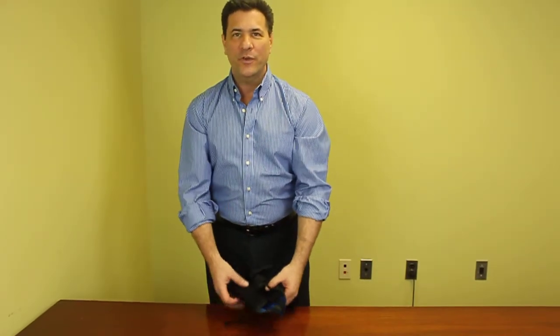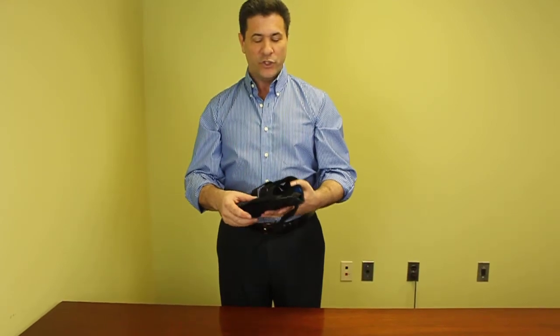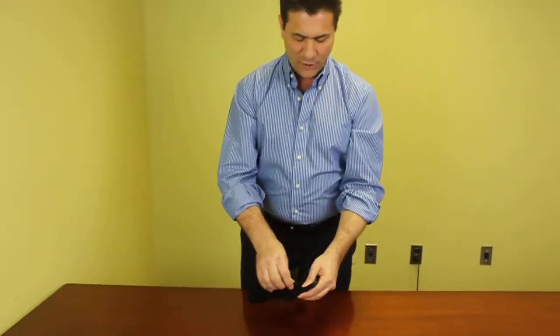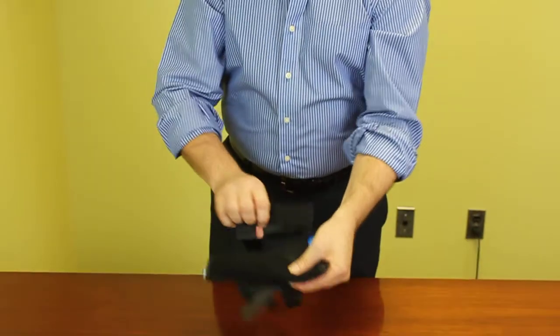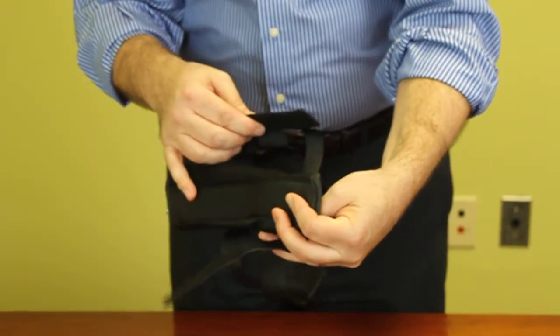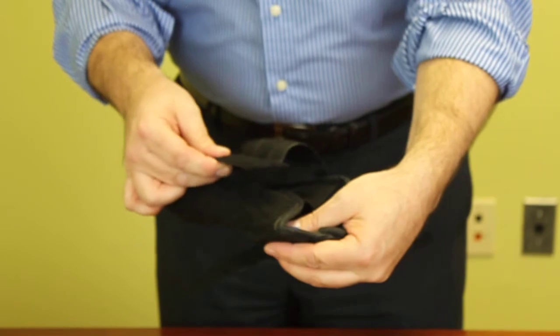Hi, I'm Andy and I'm here to demonstrate the Comfortland Universal Wrist and Thumb Splint. One of the very unique features about this device, which makes it universal, is — as you can see — we have the Velcro strap along the framework of the device, which will adjust to fit someone that has a thin wrist or someone that might have a thicker wrist, just by moving the panel forward or backwards.